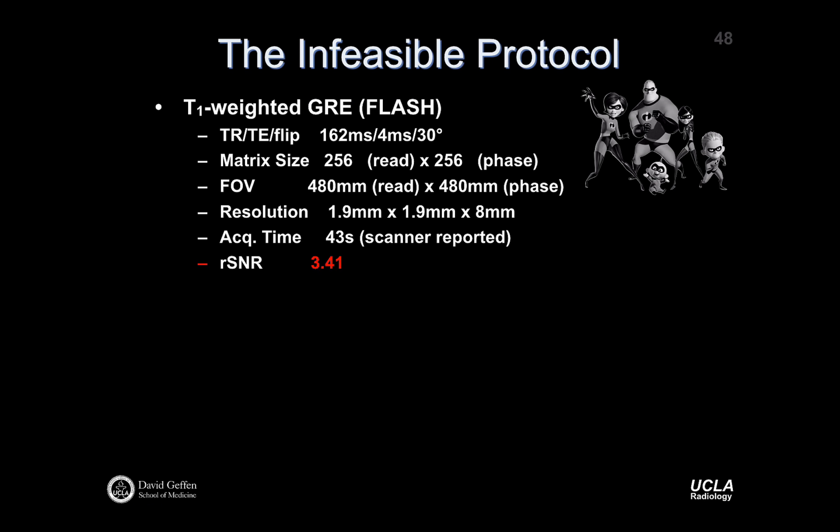In this case, this is big. This is almost 50 centimeters by 50 centimeters, right? Most of us will fit into that field of view pretty well. And let's say I choose a big matrix, 256 by 256. What's my resolution? It's going to be 2 by 2, almost, right?